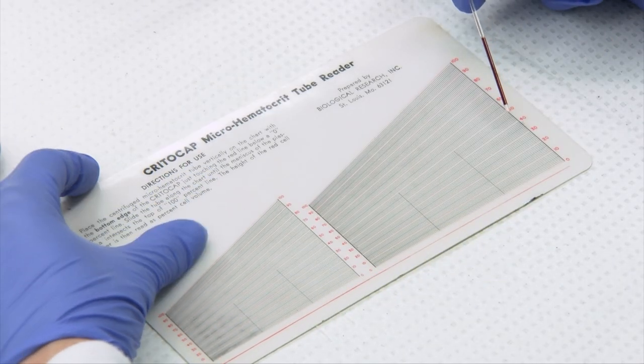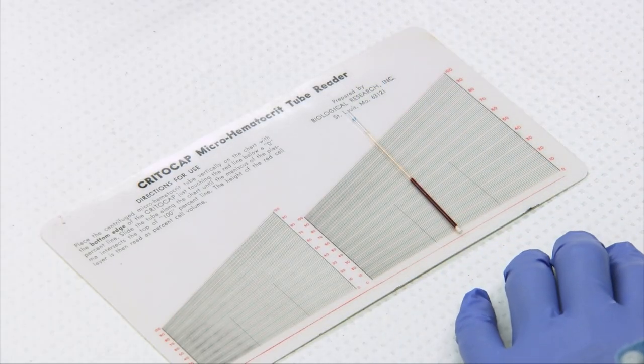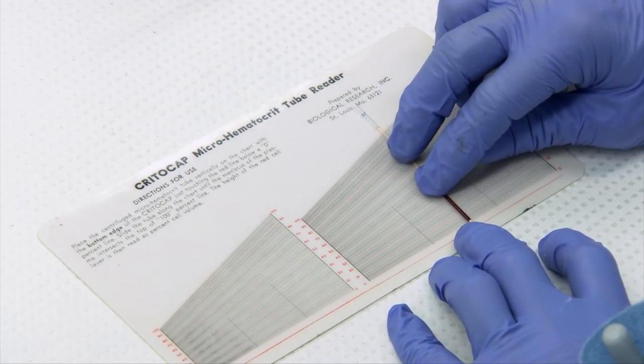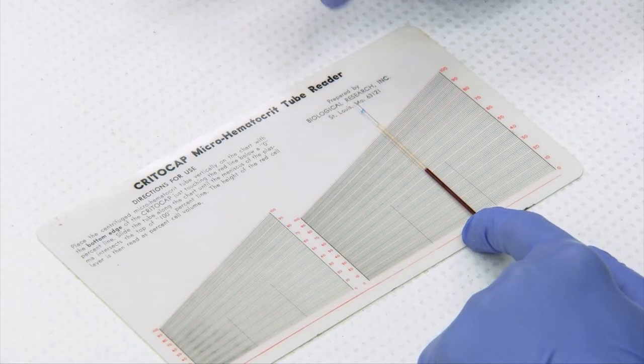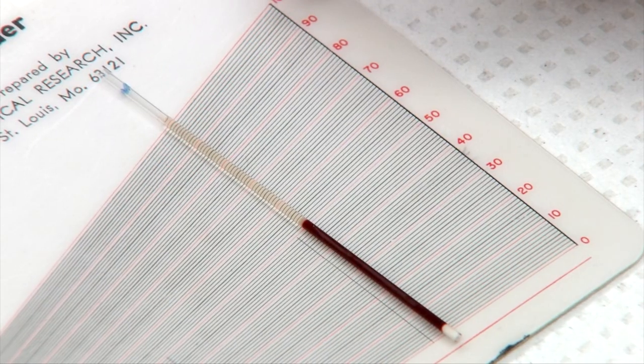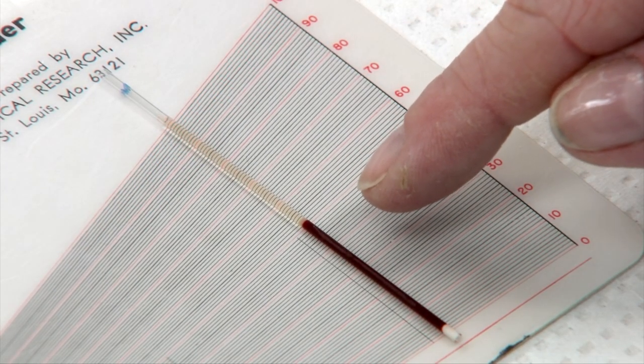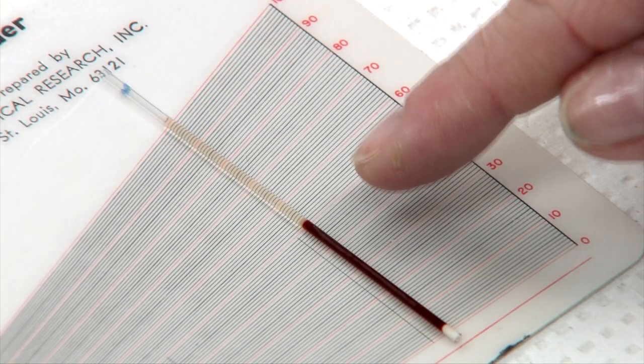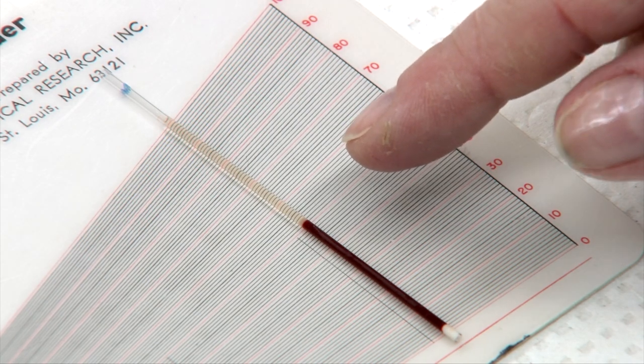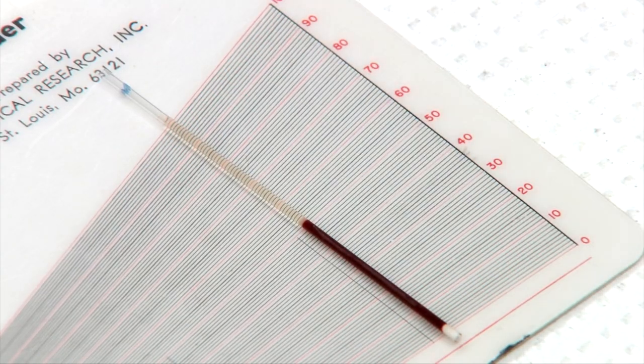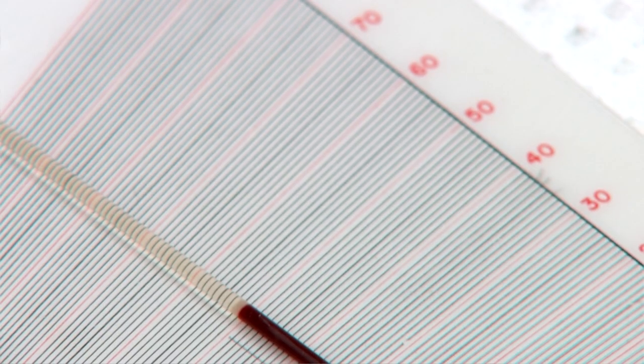The packed cell volume is determined using a reader. You put the interface of the plasticine and the blood at the bottom of the red line where it says zero. You put the interface of the plasma and air at the top where it says 100. Then you move down to find where the top of the red cell layer lies. You always want to read your packed cell volume underneath the buffy coat. The size of the buffy coat will vary depending upon the white blood cell count and the platelet count. In this case, your packed cell volume is 50% or 0.50 liters per liter.